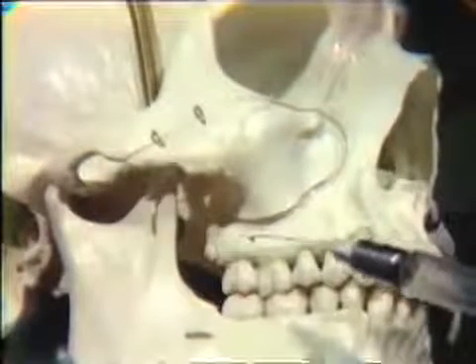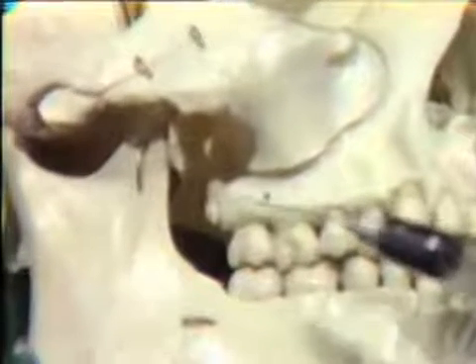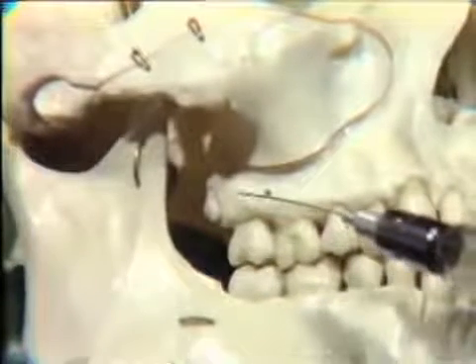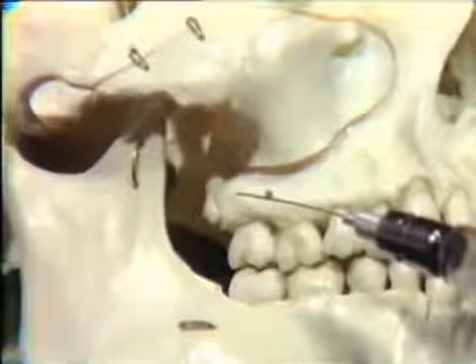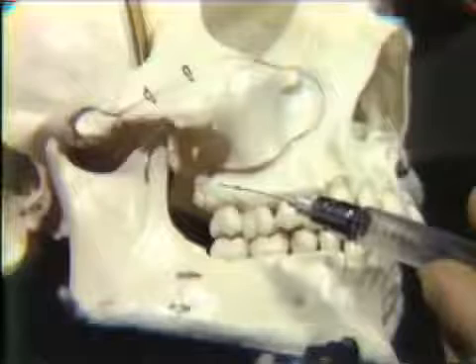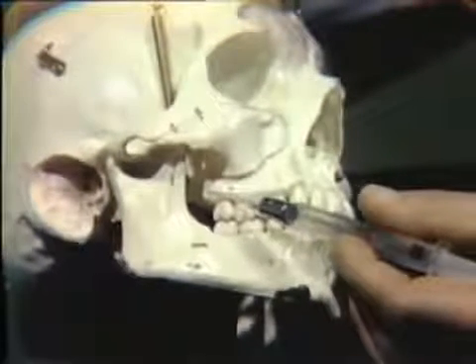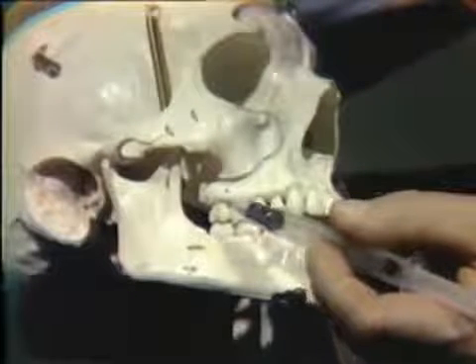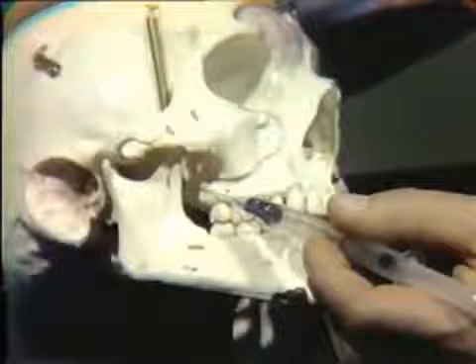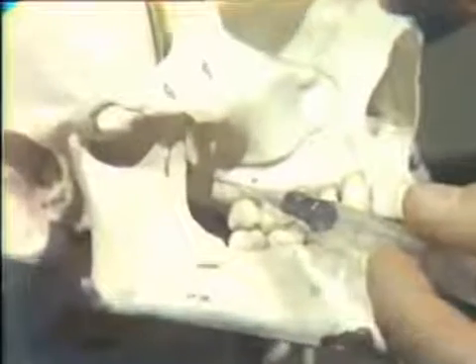and my needle puncture will be well out in the vestibule and approximately at a level of the second molar. And now if you can watch and see how I maneuver the syringe in an attempt to stay close to bone. I'm carrying it superiorly and laterally so that as we approach the foramina area, I'm going to be hugging the side of the tuberosity so that we stay close to bone and out of the pterygoid plexus of veins.